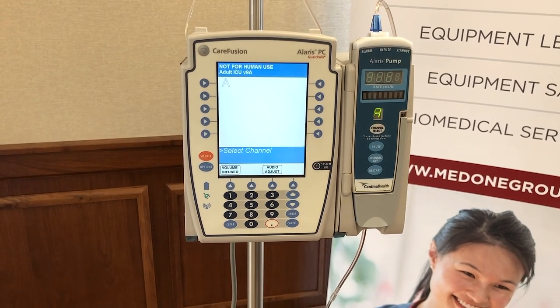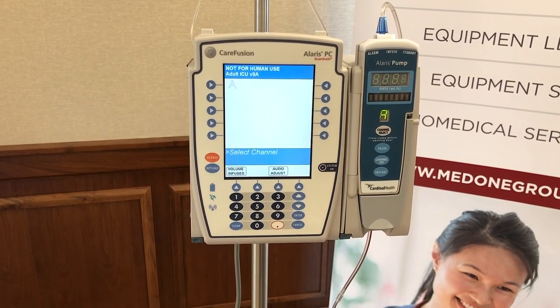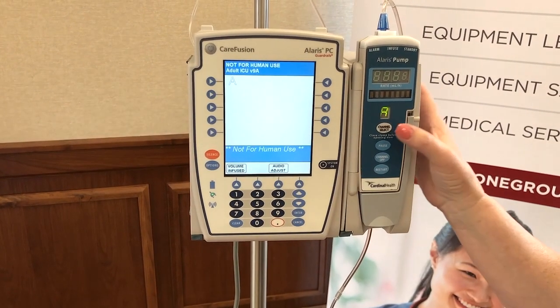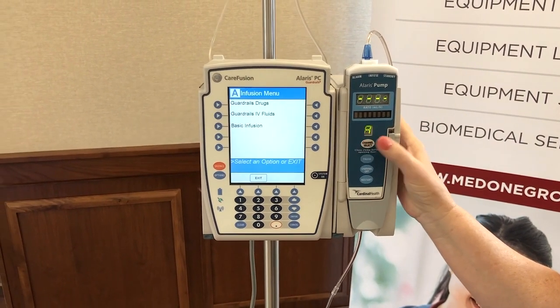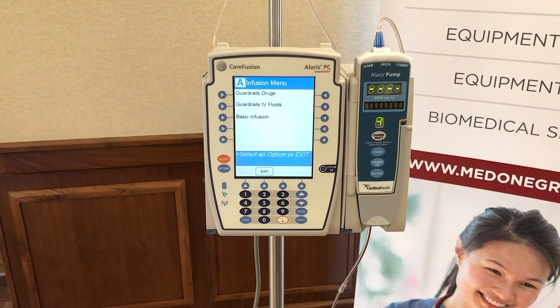The pump is now in a still mode. If you'll notice again on the bottom, the blue prompt bar is saying to select a channel. We have our tubing primed and loaded, so we're going to reach out on module A and select the channel. Here's our infusion menu: guardrail drugs, guardrail IV fluids, or basic infusion.